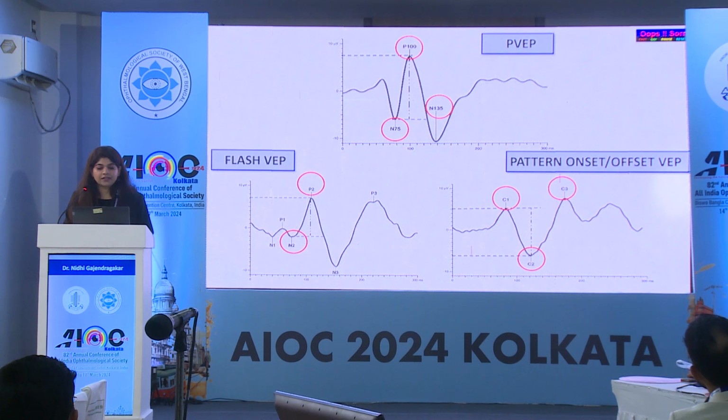These are all the waves that need to be seen for all the three major types of VEP that are done. That is all for VEP.